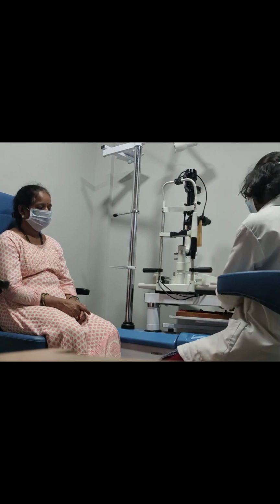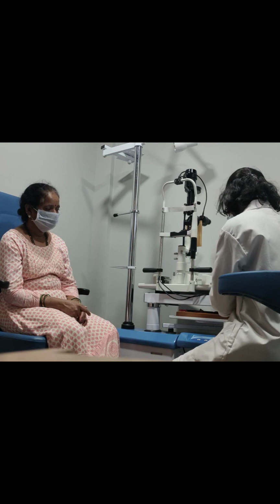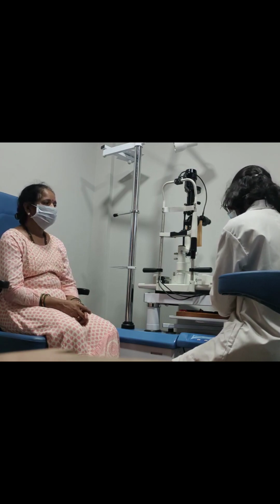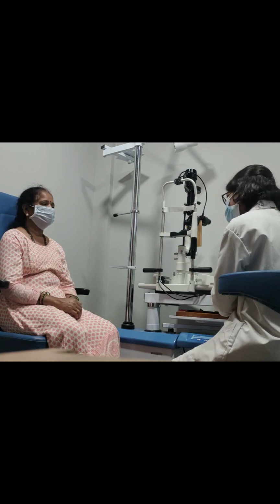Also, she can order labels for the kitchen supplies so that it can be helpful for her in the cooking area, and to take her medicines, she can use marked syringes or marked boxes to keep all her medications, tablets and everything.